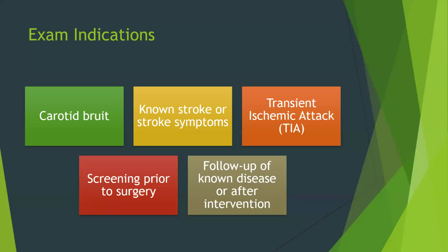So just to understand a little bit more about that as we get going here. First thing about carotid exams is we want an indication, right? So why are we doing the exam? One thing that I like to reiterate to everybody is that we are treating patients, not pictures. And what I find really important about that is that, one, listen to your patient, get a good history, get a good physical. Not only does that help you in the exam itself and understand why the patient is here, but the patient might feel like they're heard for the first time too. I think that that's really important.